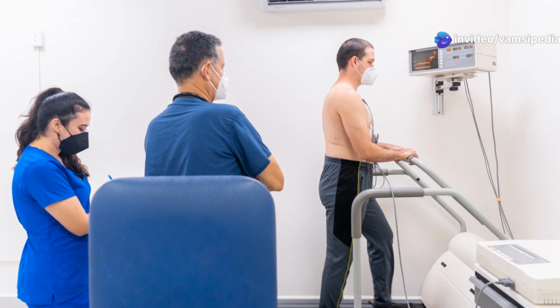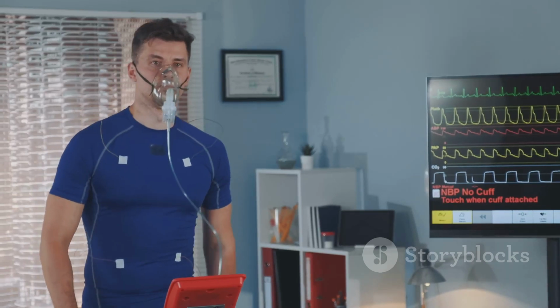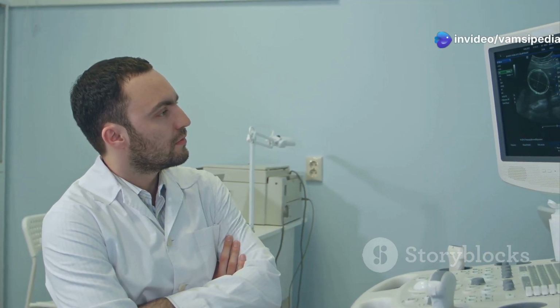This is the maximum amount of oxygen a patient can use during intense exercise. Normal values usually exceed 85% of predicted based on age, gender, and fitness level. Lower values could indicate cardiovascular, pulmonary, or muscular limitations.